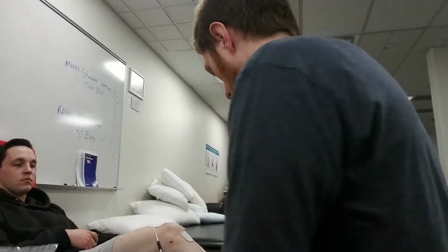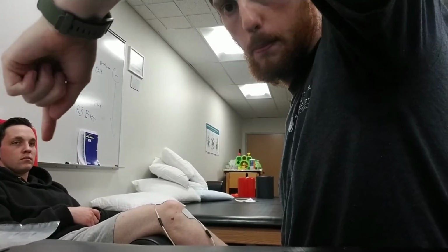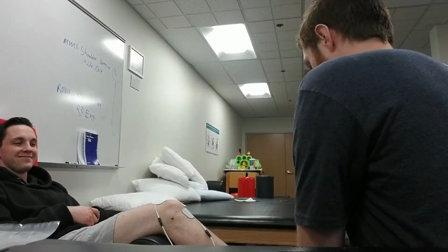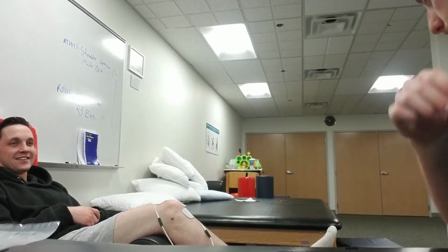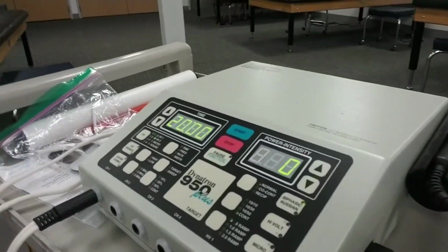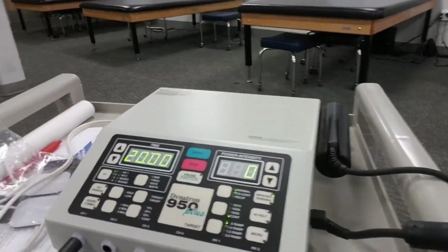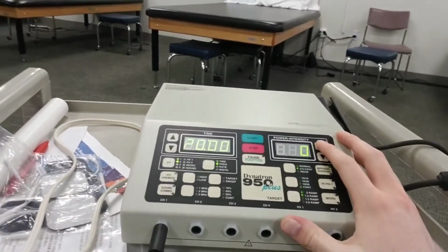Great. Okay, so I got a pad just above his knee, and just below his knee. So what I want to do is I'm just going to gradually turn up the power intensity over here, until the patient feels a comfortable tingling, and I'll just get patient feedback for that so I know what we're working with. All right, so I'm going to start turning up the machine.